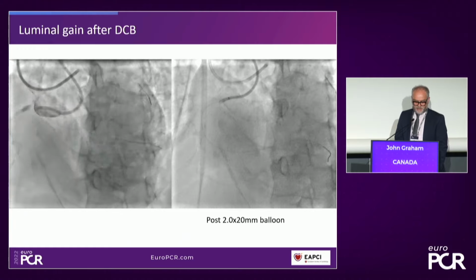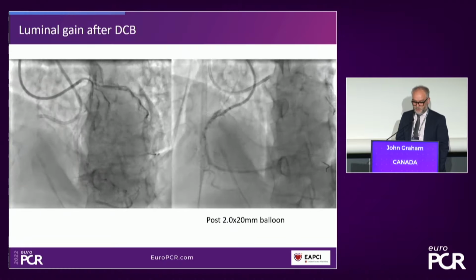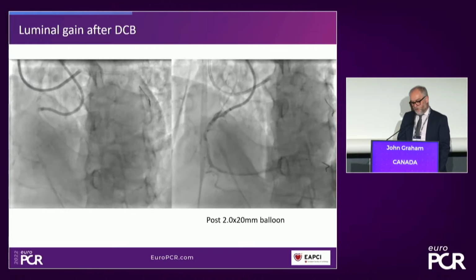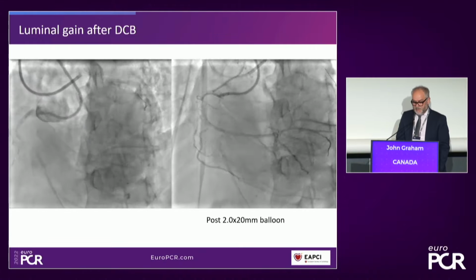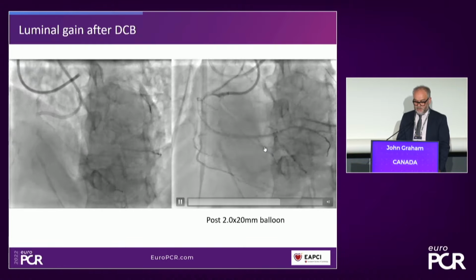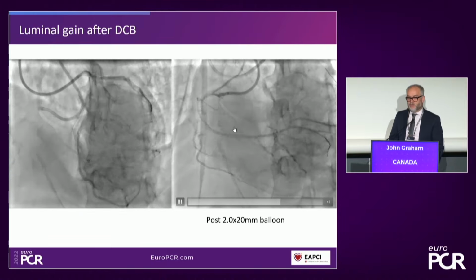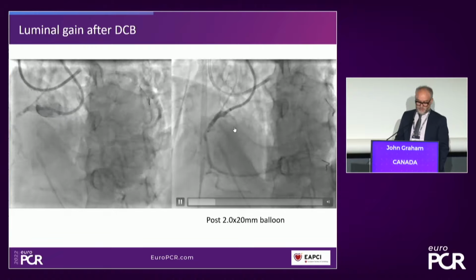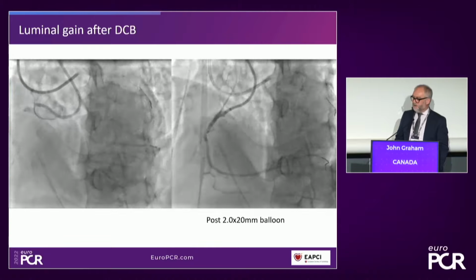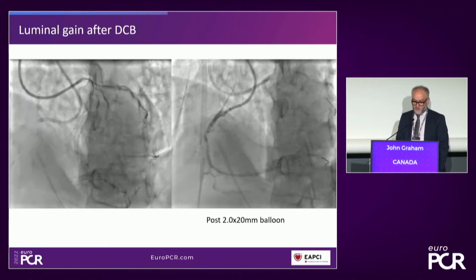Initially, the angioplasty itself was fairly straightforward. We got through with a polymer jacketed wire, switched out to a regular wire, and we ballooned with a 2.0 balloon and got resumption of distal flow. And the feeling was that to stent this, we were probably going to have to go from here, and he has plaque. And although there's been a lot of work with high bleeding risk patients, and they may say that you can, this is almost 10 centimeters of stent, and I would be reluctant with abbreviated dual antiplatelet therapy. So it was further pre-dilated with a 3.0 balloon.